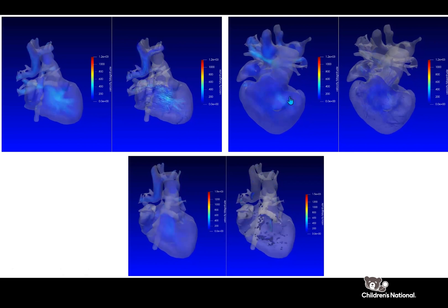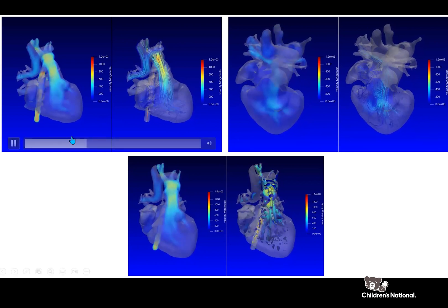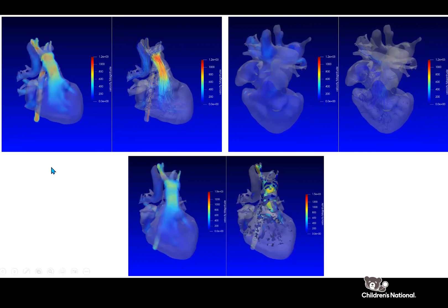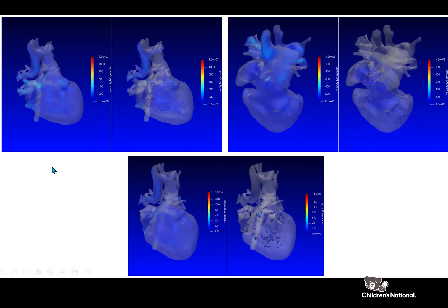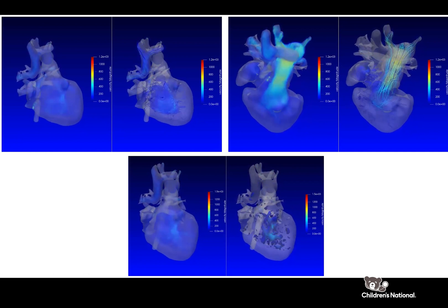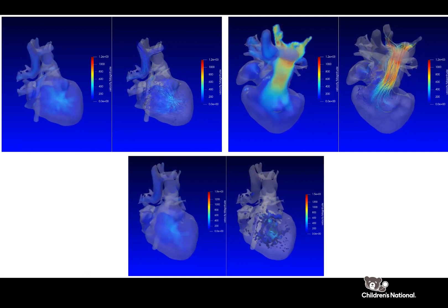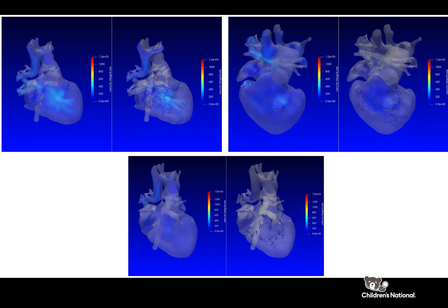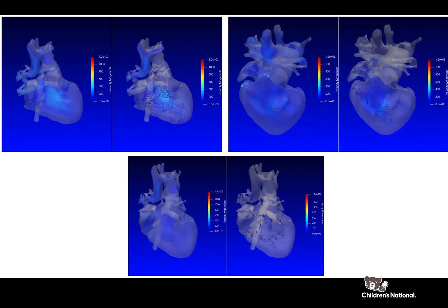On the screen here, you see a set of images that were obtained with a special cardiac MRI sequence known as 4D flow. 4D flow represents the measurement of blood flow in all three directions over time, the fourth dimension.